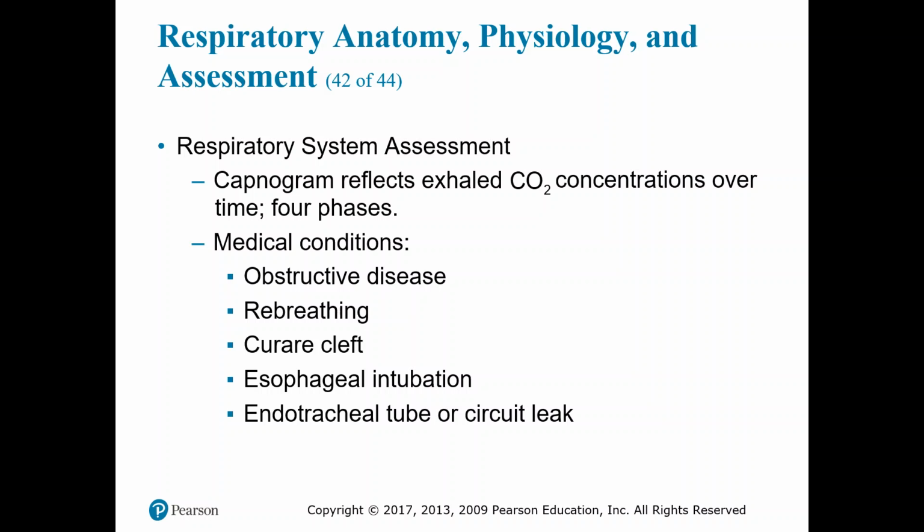Esophageal intubation will show an absence of a waveform. You won't have anything. It won't move because it's not getting the end tidal CO2. It's not getting any CO2. It's a sample, so it has no choice. The capnogram has no choice but to remain on 0. There may be a small disorganized waveform indicative of end tidal CO2, but it will not move. You should have some movement if your tube placement is correct.